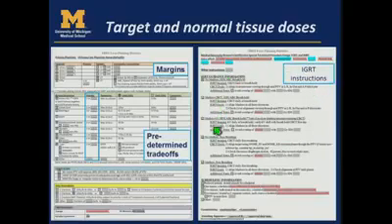Over here, we have a section on IGRT guidance. For any different scenario, there's instructions for it, so that at the machine, the therapists know how you'd like to have the guidance. Whether it's to fiducials, whether it's to avoid a particular normal tissue, it's really important to communicate that. Otherwise, there will again be guessing, and that's not going to be consistent or necessarily safe.